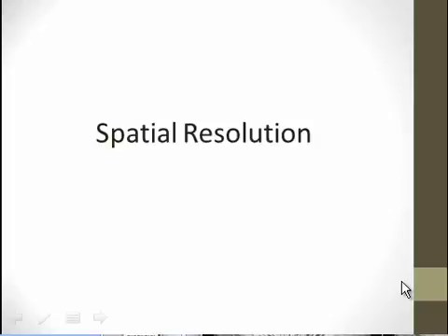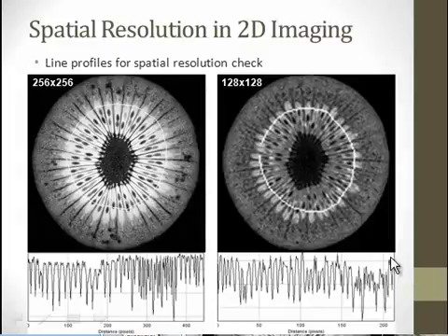So, one quick slide about spatial resolution. The two images here are from different scans, so you really don't want to compare the contrast directly. On the left is from a gradient echo sequence. On the right is from a fast spin echo sequence. And the reason I used these sequences was to calculate the actual T1 and T2 star times of the fruit.